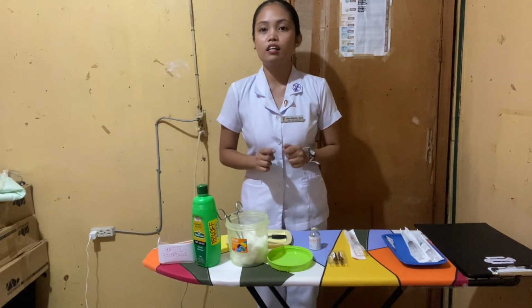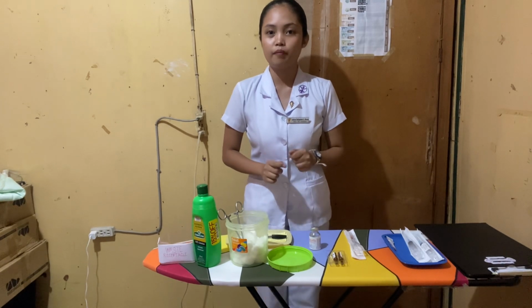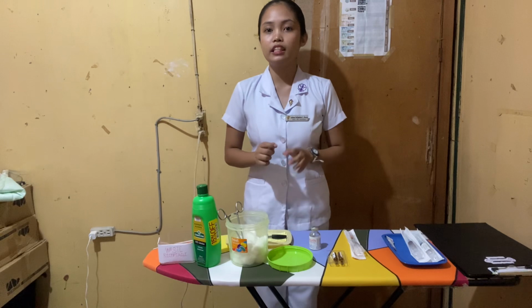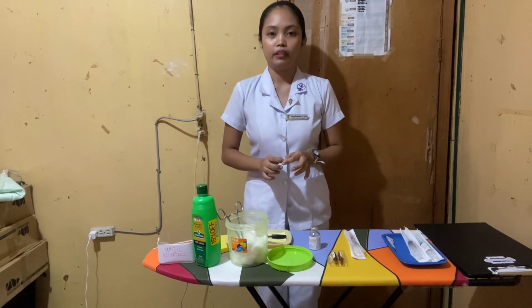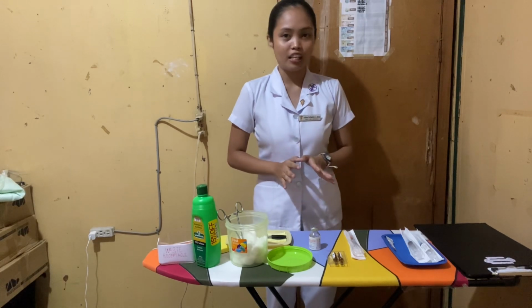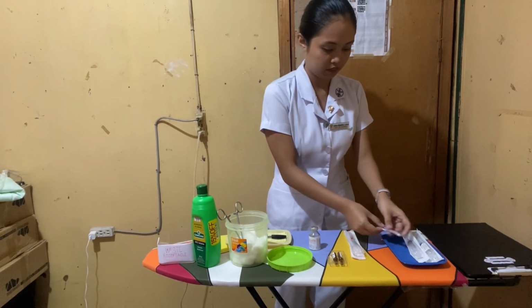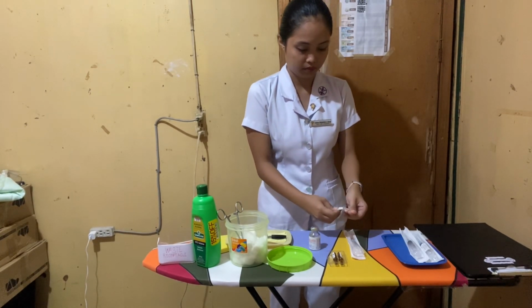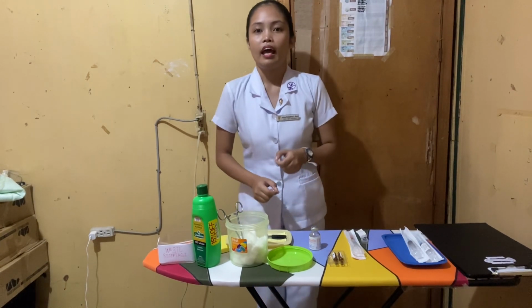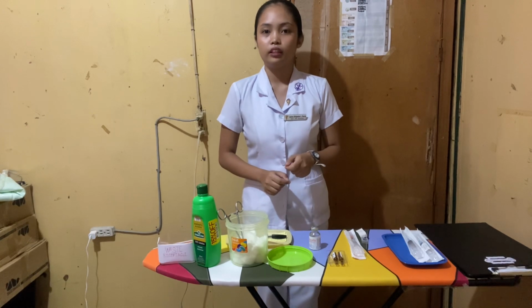Now since this comes with a needle already, I'm going to loosen it first so that I can connect my tuberculin syringe to the aspirating needle. So now I'm going to open the aspirating needle and then connect the needle to the barrel.